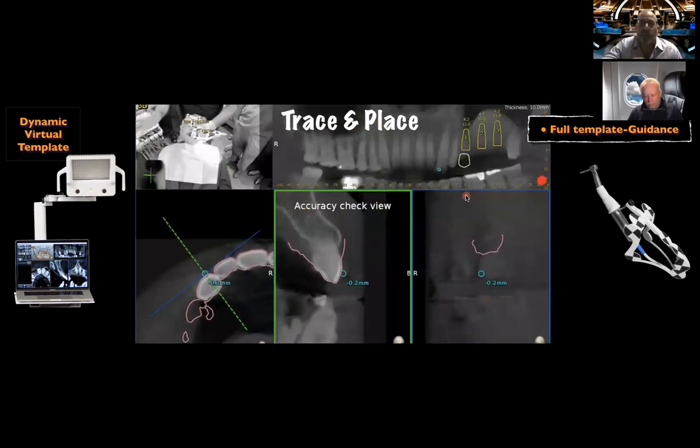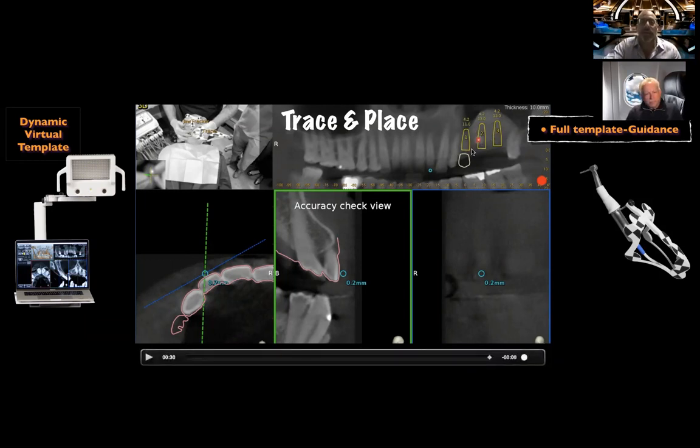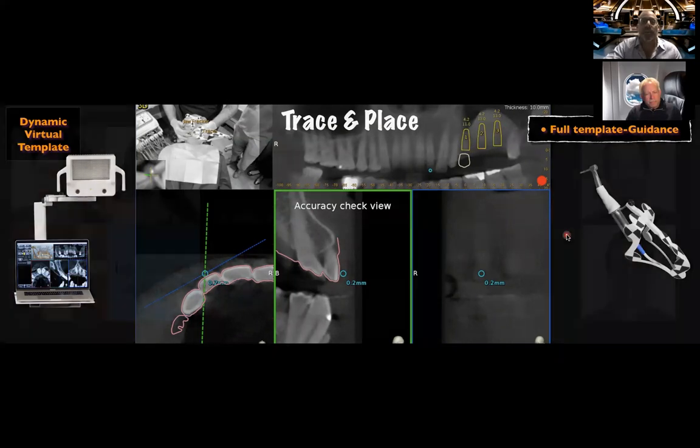It's nice to have an intraoral scan as well to overlay that, especially if there's a lot of metal. But if there's no metal, like in this case here on a mannequin, we can plan our cases without interference. We can do this just from the CBCT, get points of registration, and simply get to work. It's just a matter of importing the CBCT into the software, selecting a few dots, tracing around those dots, and now you have your virtual dynamic template. We can plan the implants like you're seeing here, and then go ahead and place them.